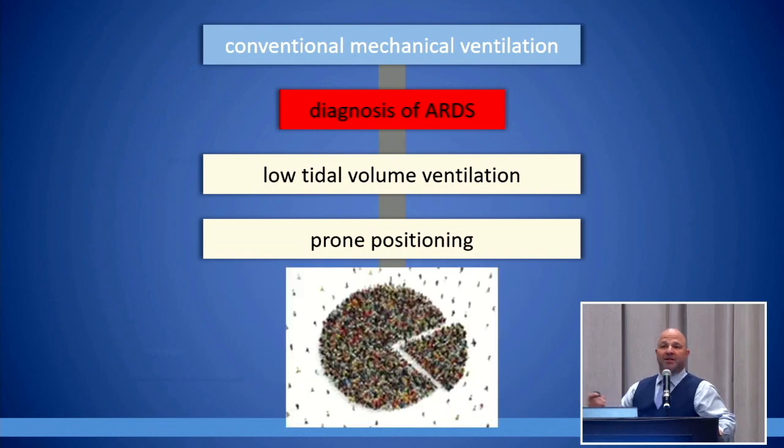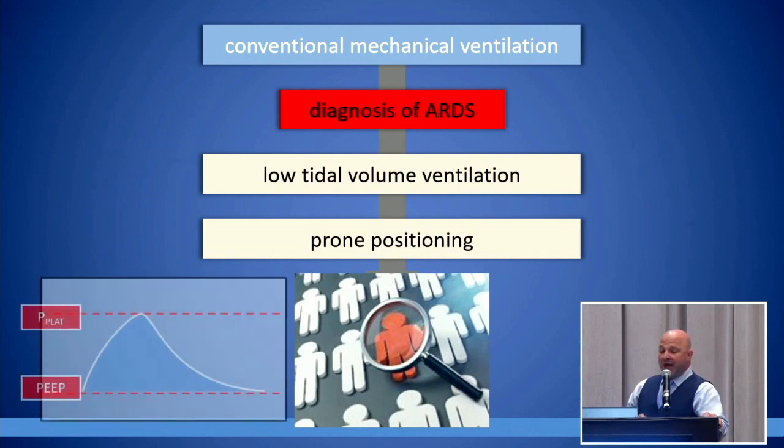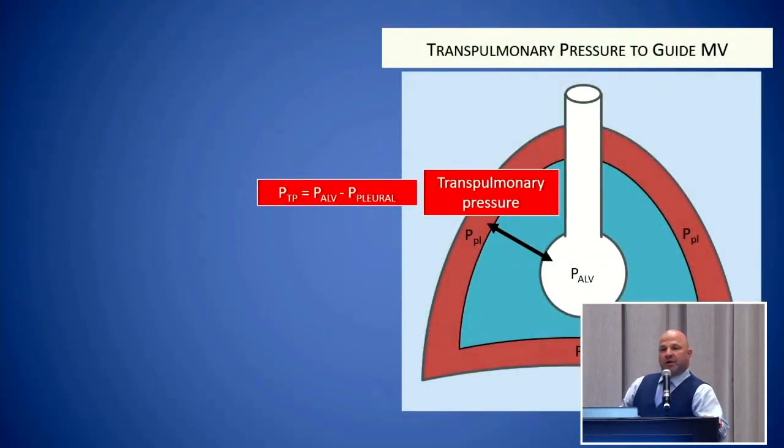And so you're going to have to pluck this guy out of protocol and really, really individualize their mechanical ventilation strategy. And so the first thing that I gave you, driving pressure, is an individualization of mechanical ventilation, right? It is using a volume for that patient that even though you check the box of 6, and even though you check the box of a plateau of 30, if your driving pressure is still 18, that's too much volume, right? And so you're starting to individualize them based on this idea of driving pressure. That's number one. Number two is this whole idea of transpulmonary pressure.